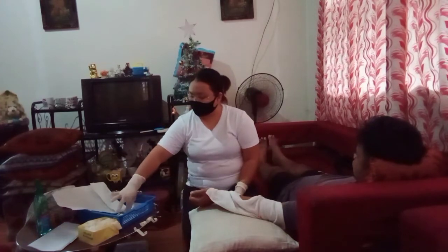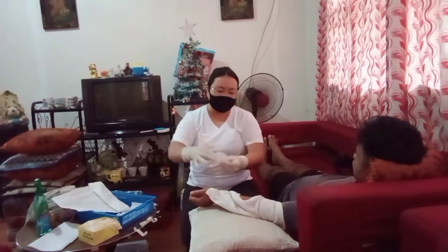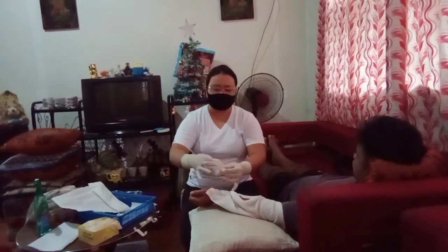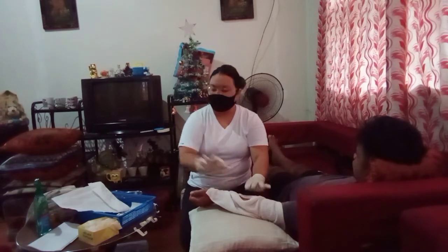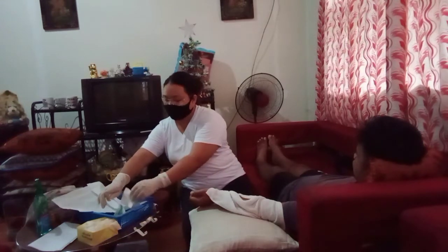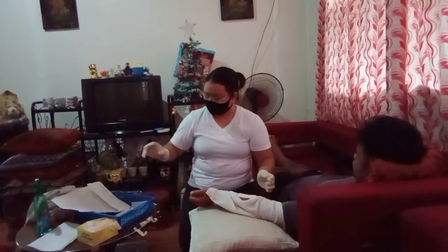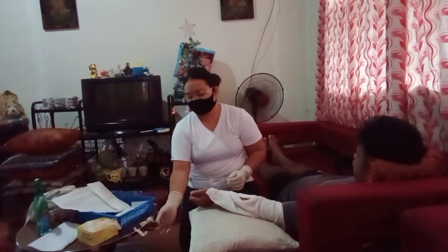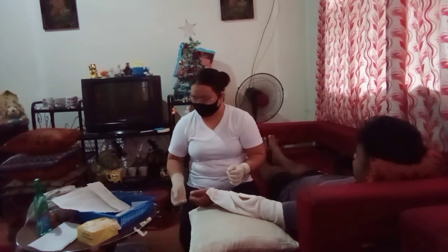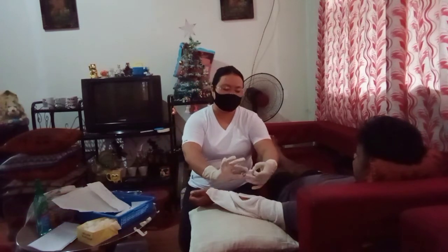And then you can get a clean dry gauze, and then another layer, and then a thicker wound pad. And then you can tape it. By the way, this is for the dry dressing.